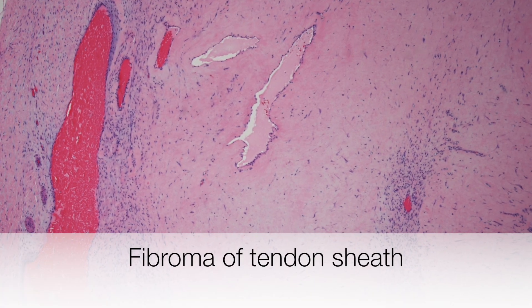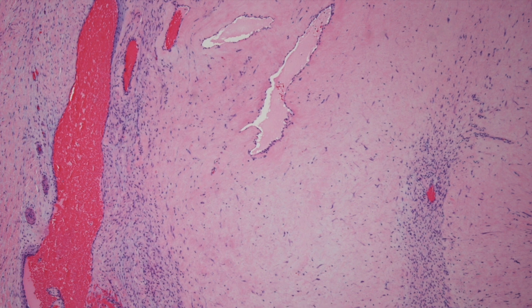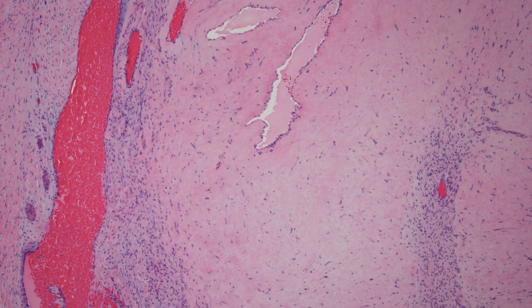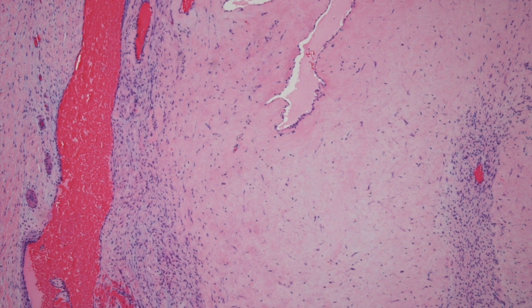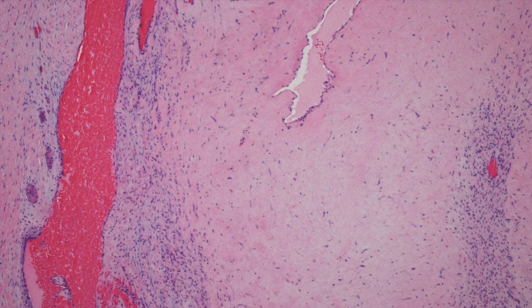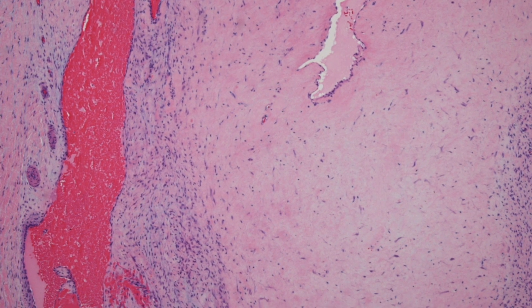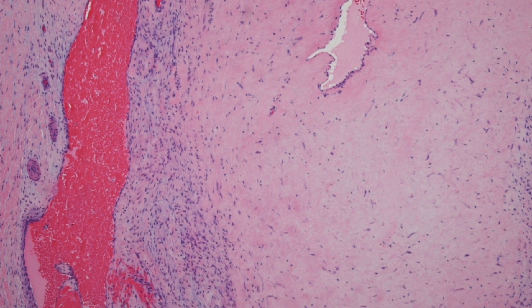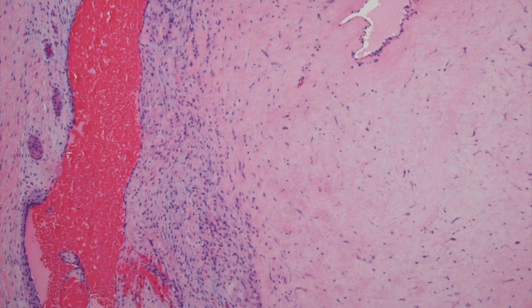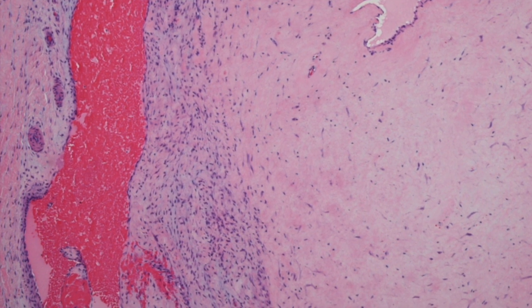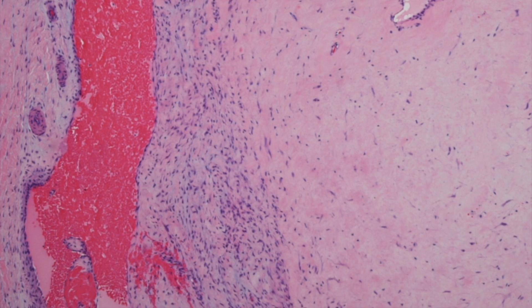This is a low-power view of a fibroma of tendon sheath. You can appreciate two things: first, the lesion has a rather lobulated appearance, and secondly, you can see that there is variable cellularity. Towards the left of the picture is a dilated blood vessel.